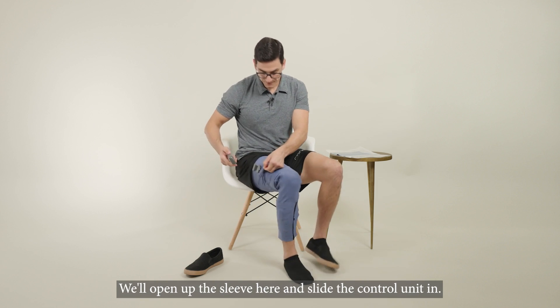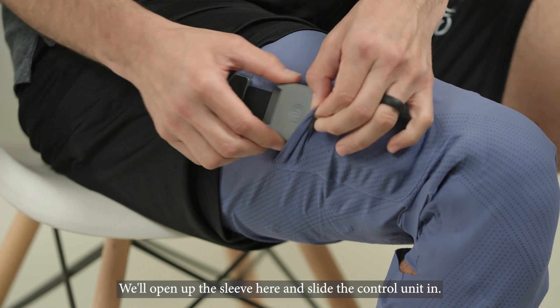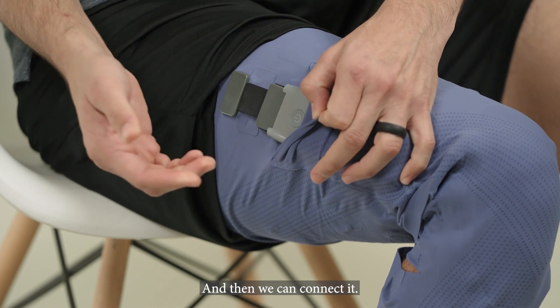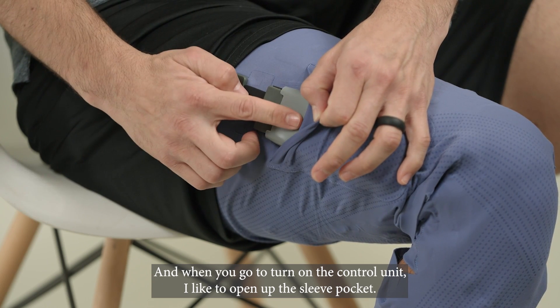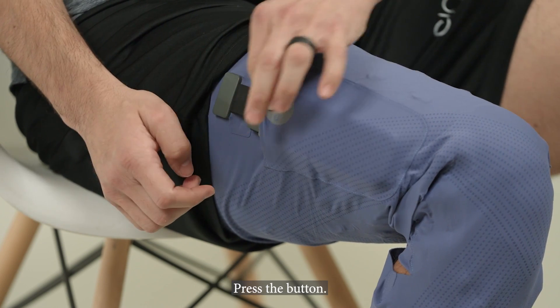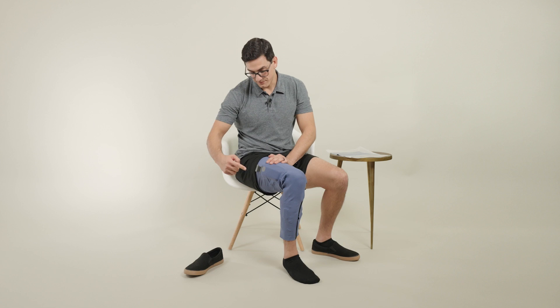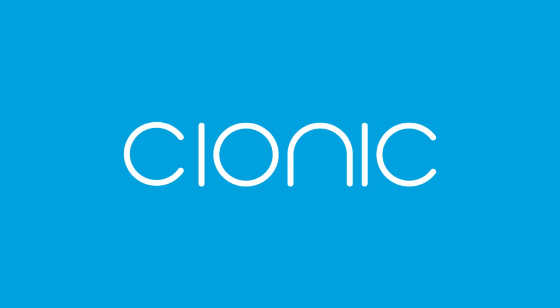We'll open up the sleeve here and slide the control unit in. This prevents any unnecessary stress to the cable, and then we can connect it. When you go to turn on the control unit, I like to open up the sleeve pocket and press the button — you can, however, press it through the sleeve as well. Now that you're all set up, we're ready to get started. Let's get started.